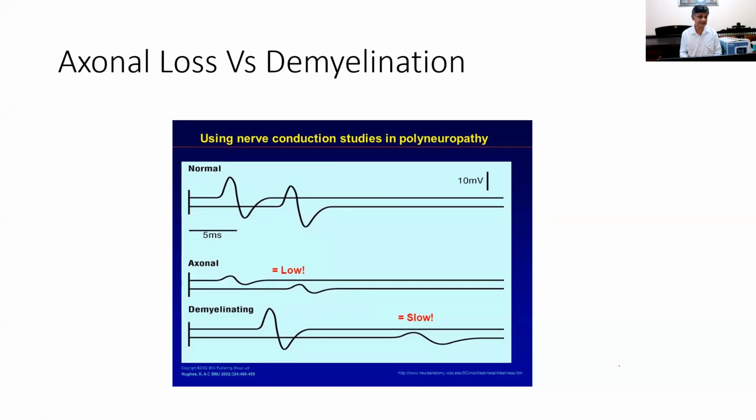And in addition, there are other tests. Sometimes you stimulate here and you record here, and you record using a different mode in the ENG machine. So initial recording comes, but then the wave, rather than coming here, goes retrograde. The pattern goes to the spinal cord and comes back and stimulates the muscle again, and you get another wave, what is called F wave, right? So those studies are also there just to study any compressions in the elbow, the axilla, or the root lesions. Those can also be suspected or diagnosed using special ENG studies, but those are beyond our scope, right?